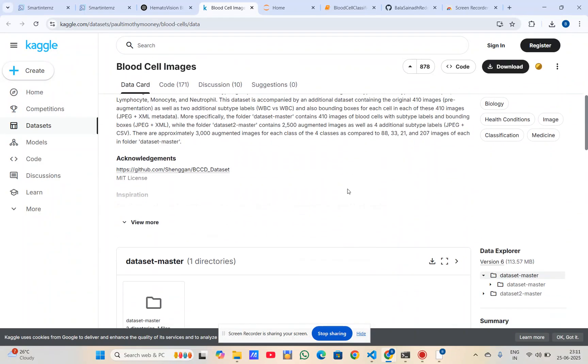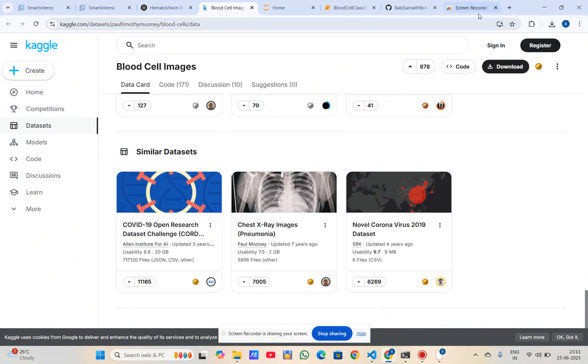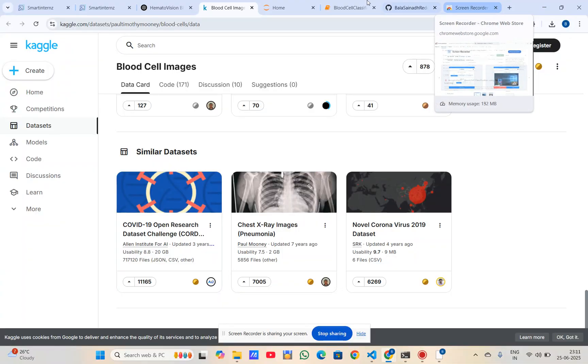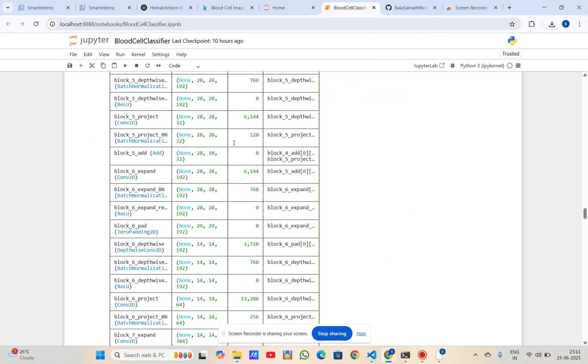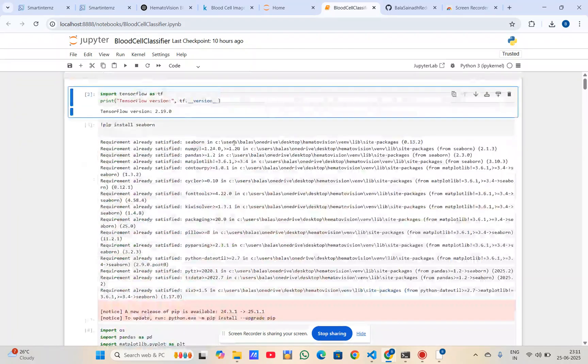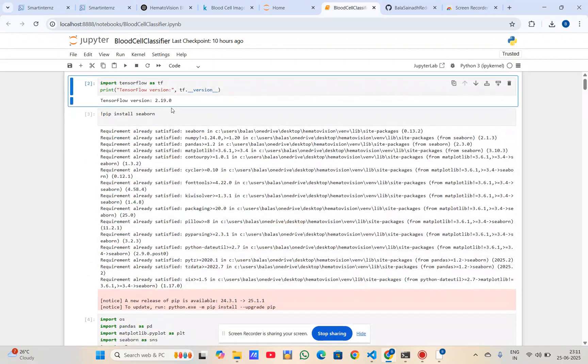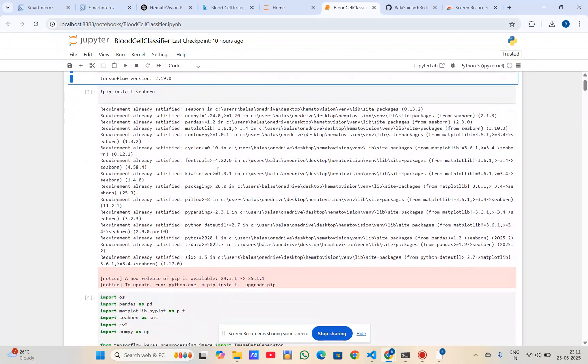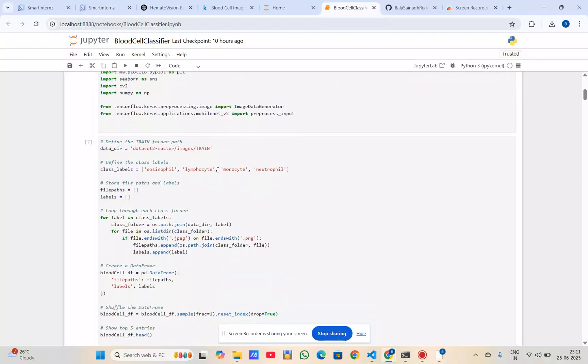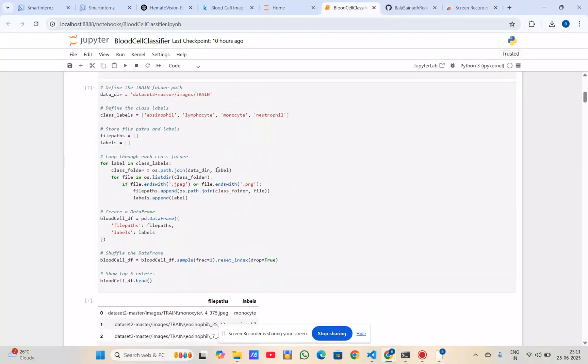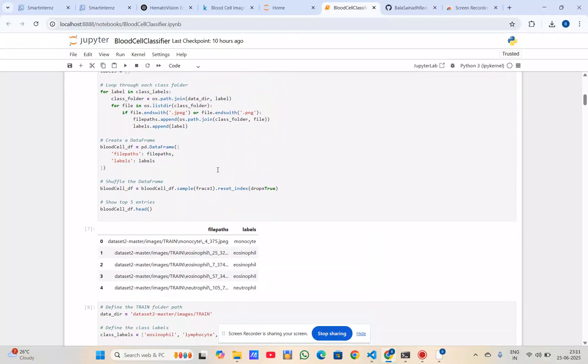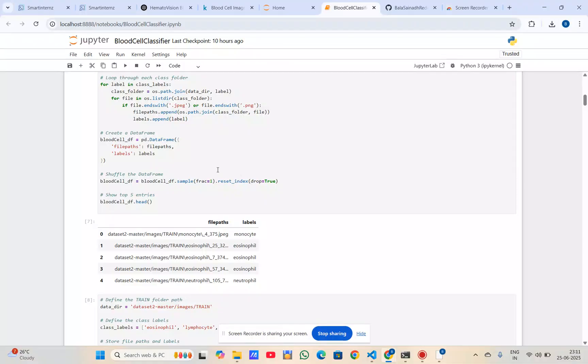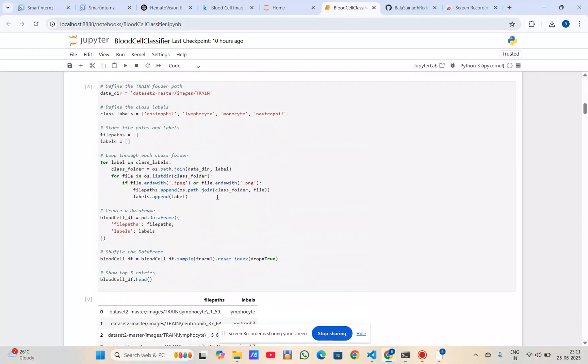We developed the model in Jupyter Notebook. Firstly, we imported all the required libraries and the training dataset. We also performed data augmentation to increase the dataset size, and then we created the model.